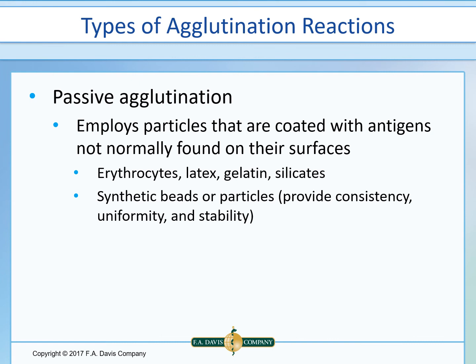Passive agglutination tests using latex agglutination have been developed for antibodies to group A strep and to viruses such as rotaviruses, cytomegalovirus, rubella, varicella zoster. Because many of these kits are designed to detect IgM antibody, and there's always the risk of non-specific agglutination caused by the presence of other IgM, these reactions need to be carefully interpreted.